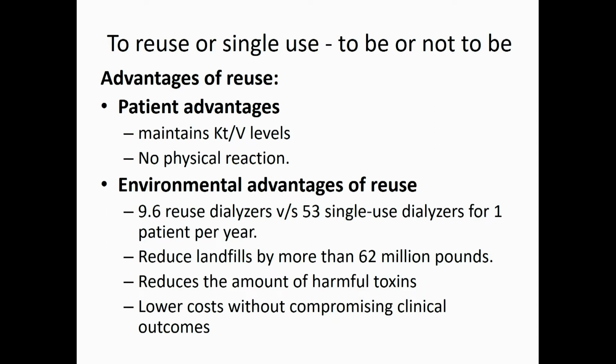So you have to believe the manufacturer's quote that they have given. What we did is we looked at this and checked one entire batch. The variation is about 3 ml. For the F6, it's 78 and that's plus or minus 3 ml, which is negligible. We can just disregard it, I guess.